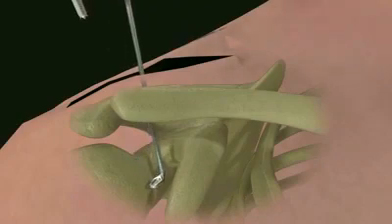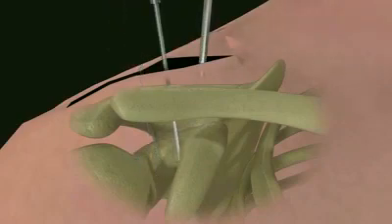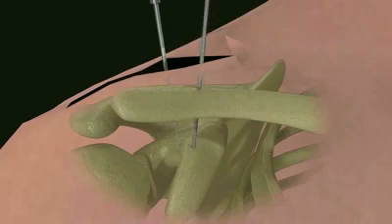Create a 1.5 cm longitudinal incision over the clavicle. Drill the guide pin through the clavicle and coracoid.